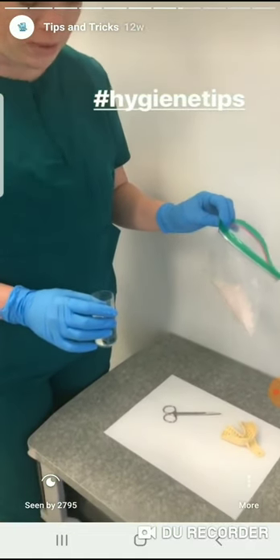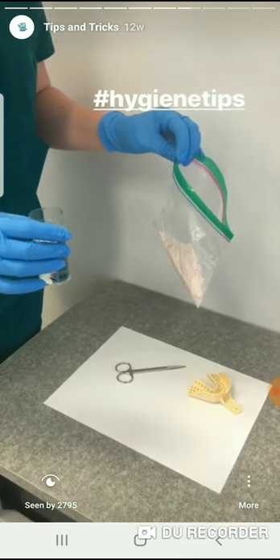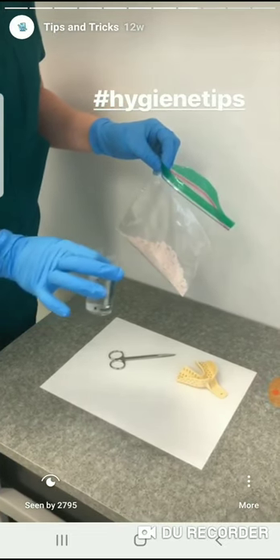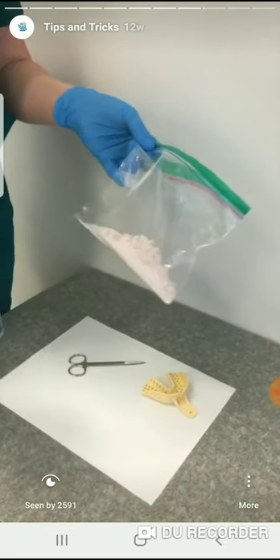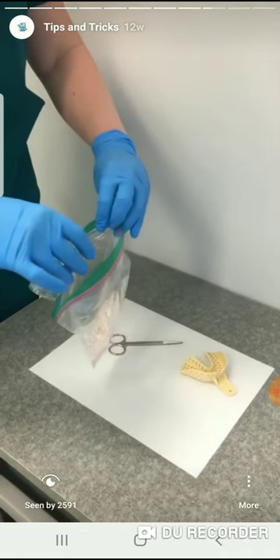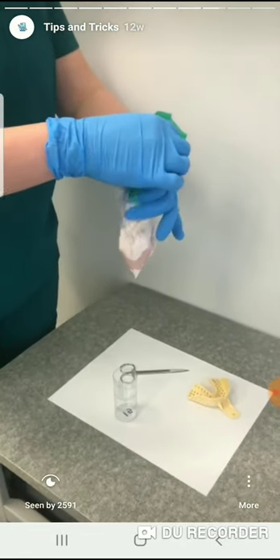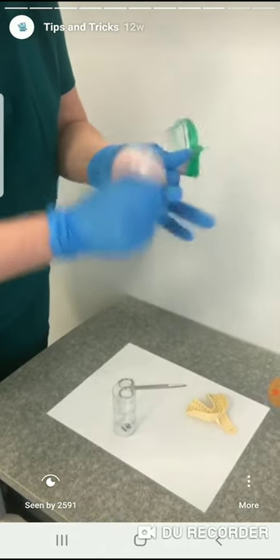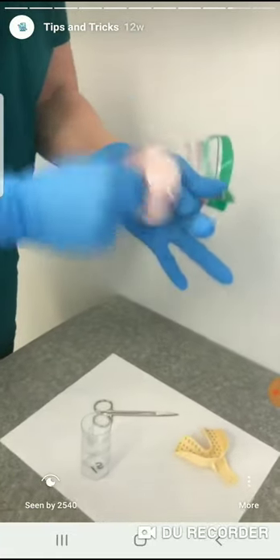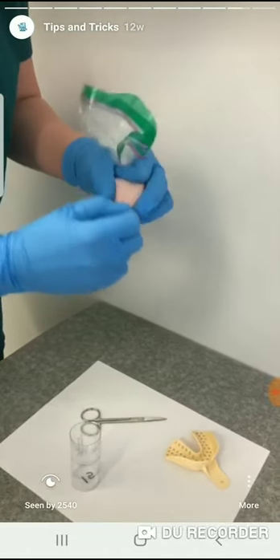A little tip when mixing alginate for making bleach trays or other things where you don't need a super perfect impression: mix it in a bag. I've got my pre-measured water and alginate in a little plastic bag. Pour it in, leave a little bit of air in it, and mix in a circular motion until it's ready to go.